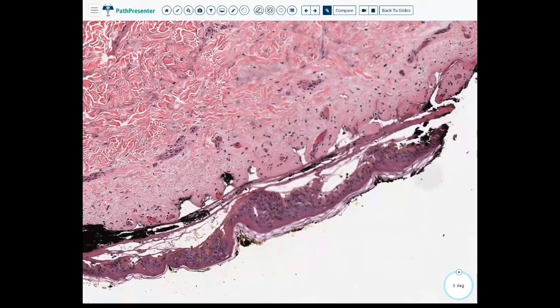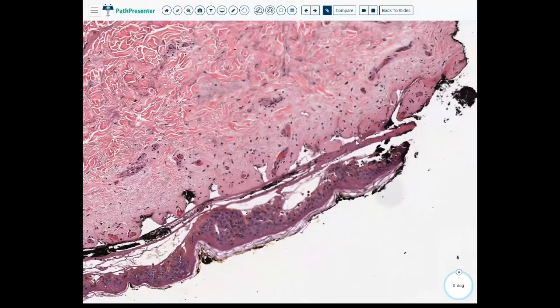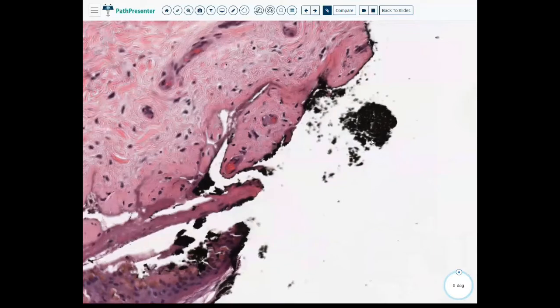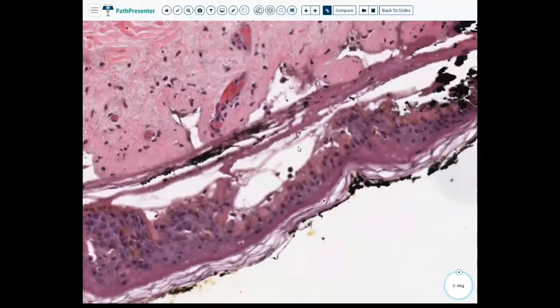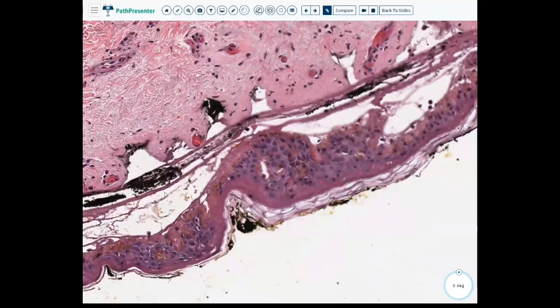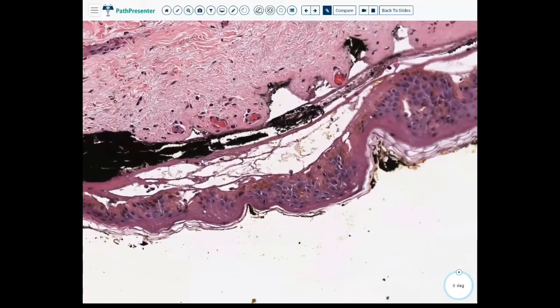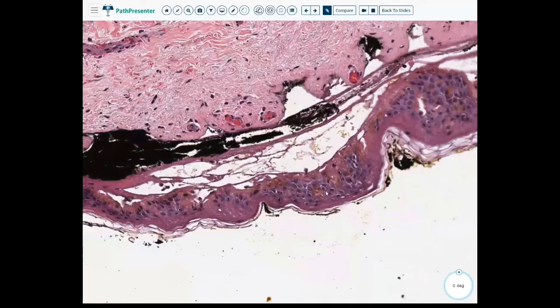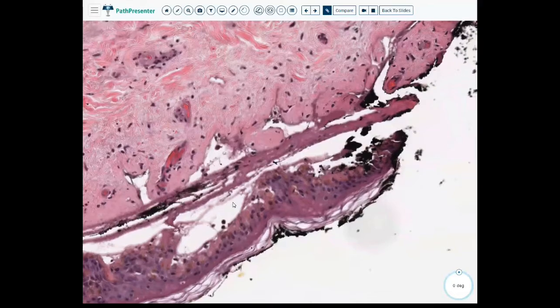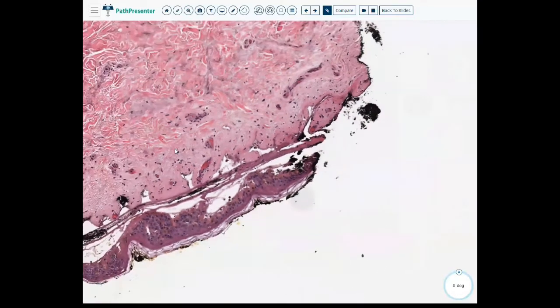We do have this vesicle or bullous space. There are increased melanocytes within the basal layer in this example, as we've seen in other examples. There is spongiosis, but within the bulla itself, there's really nothing. And it's a little hard to make out if there's any real detail, because it's just a little on the blurry side. It looks like there's also some actinic change or solar elastosis.